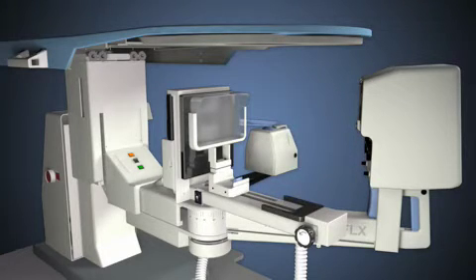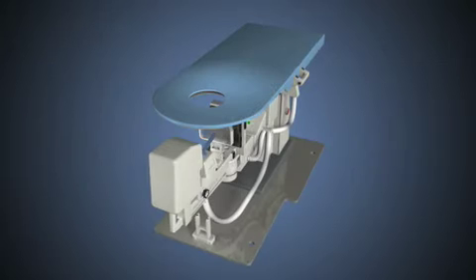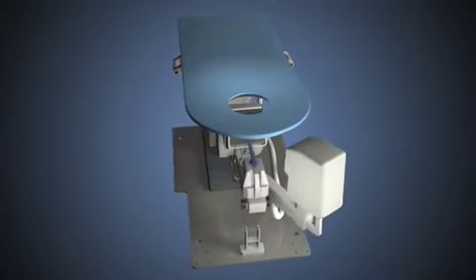This allows access to all lesions, including those near the chest wall and axillary regions. The larger opening in the table allows patients to easily position their arm through the hole, improving the anatomical position of the breast for a biopsy.